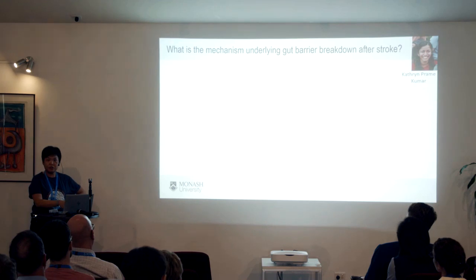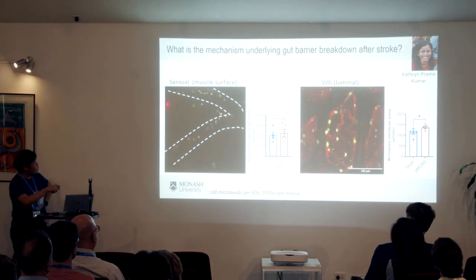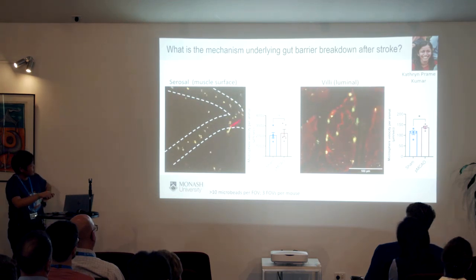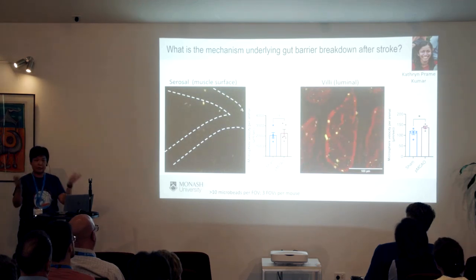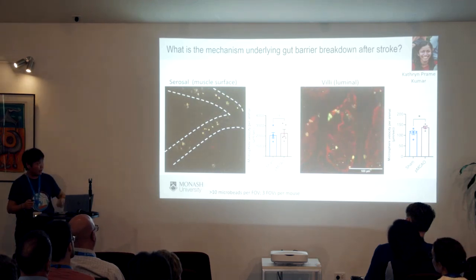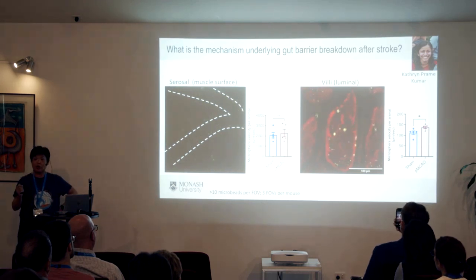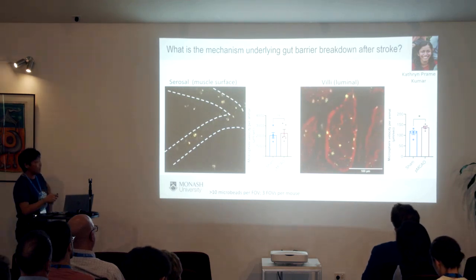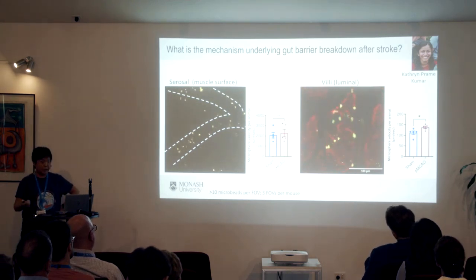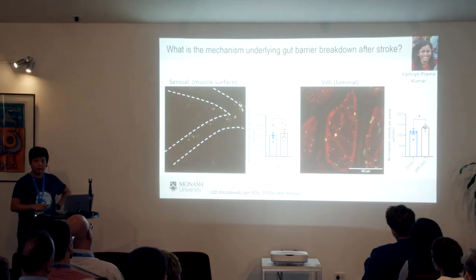As I prompted to you, we do intravital microscopy in the lab. So we've set up two intravital microscopy of the gut in the lab. One is looking at the muscle layer of the gut, so the surface of the gut. The other is actually opening up the gut, and now we can visualize the villi. Here, the yellow beads or the green beads you see are microspheres. They are inert microspheres where you can inject IV into an animal and then use that as a surrogate marker for perfusion rate.